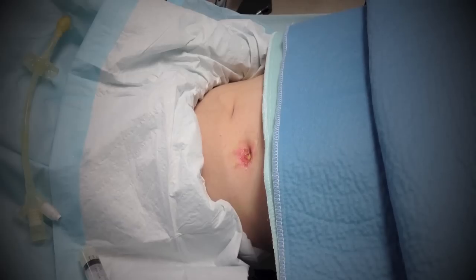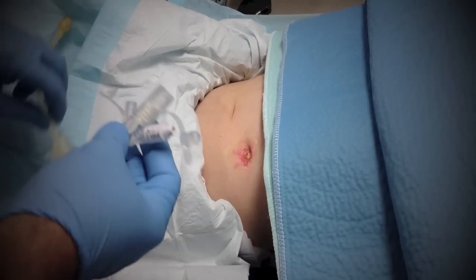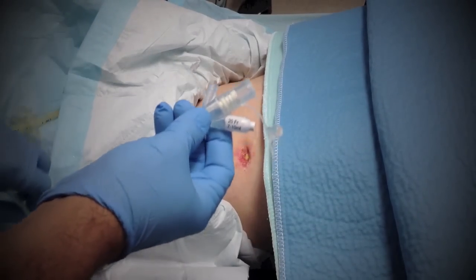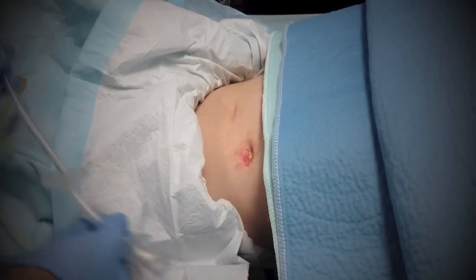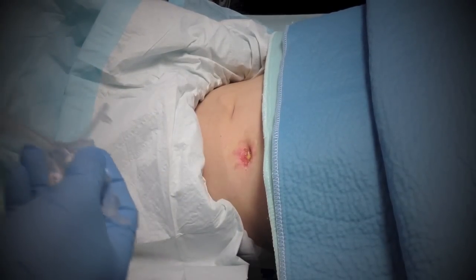For the procedure, we always want to replace it with the same size or maybe even a little bigger. You never want to go smaller unless you don't have anything else or it's a difficult insertion. So a 20 French — 20 French. And you can see the colors change because over time it just changes.